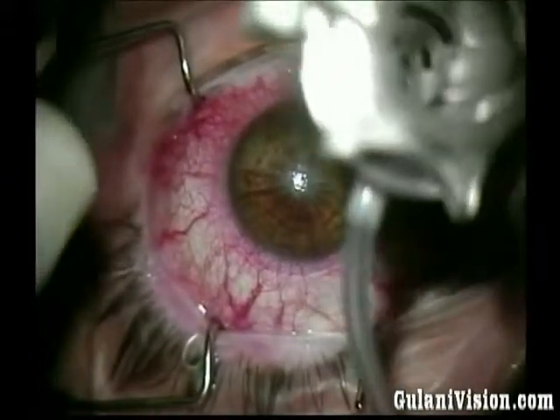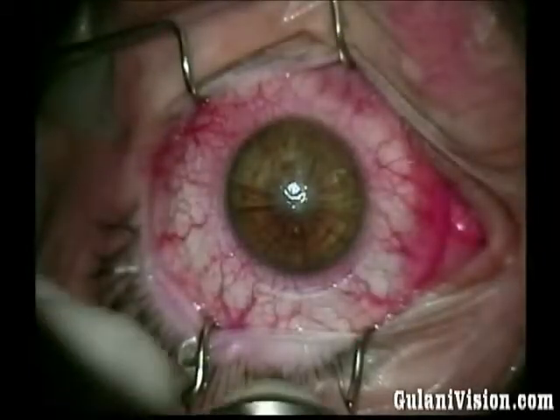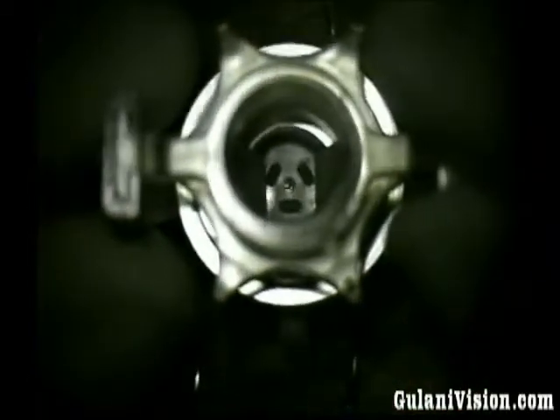I am now placing the trephine to make sure my marks are preset — not going to cut through the arcuate incisions into the eye, but stay just outside. I am happy with the mark and proceed with vacuum.